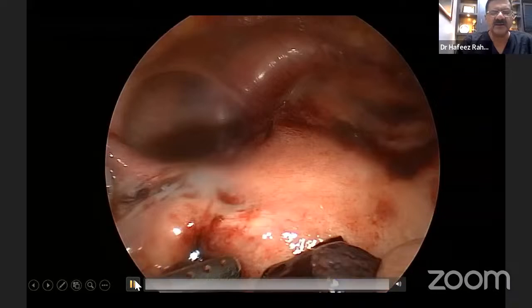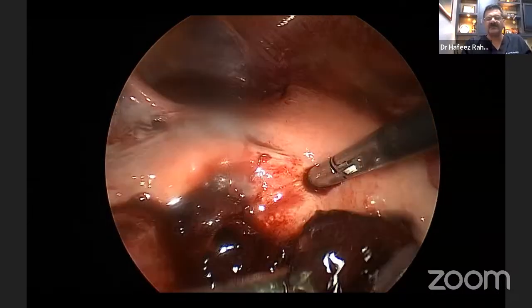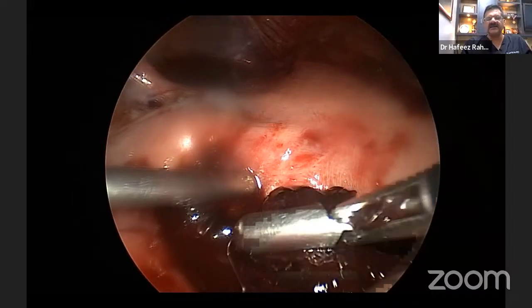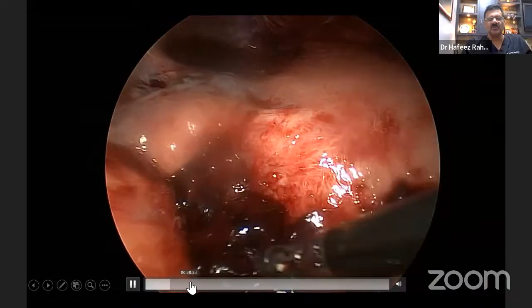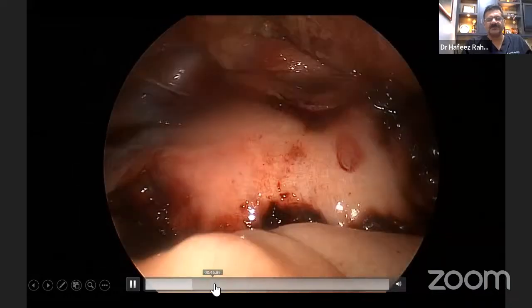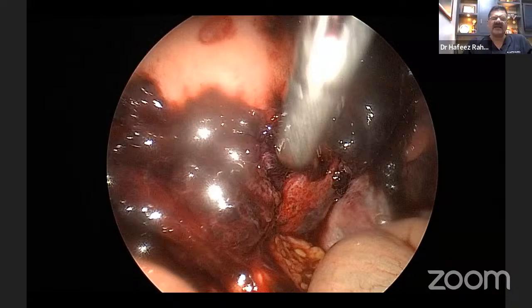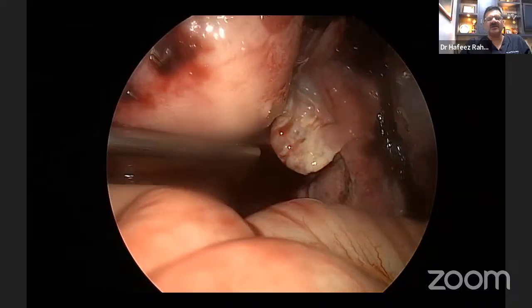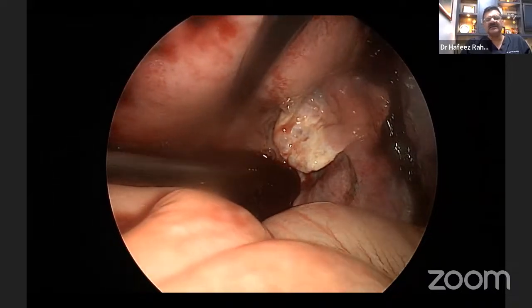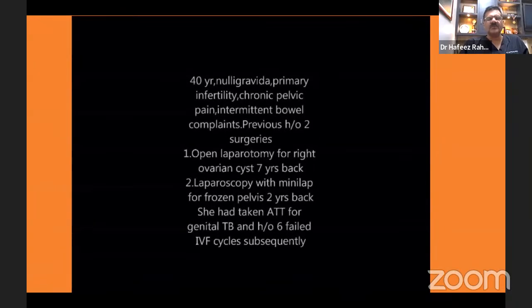Here you can see another case of bowel adhesion and formation of subacute obstruction, with a paralytic ileus kind of picture, which is due to barbed suture. In the literature we have some cases of barbed sutures causing this kind of bowel obstruction, but in reality it's a very rare phenomenon. We just had one case, that's why we are showing it, but it's an extremely rare phenomenon.